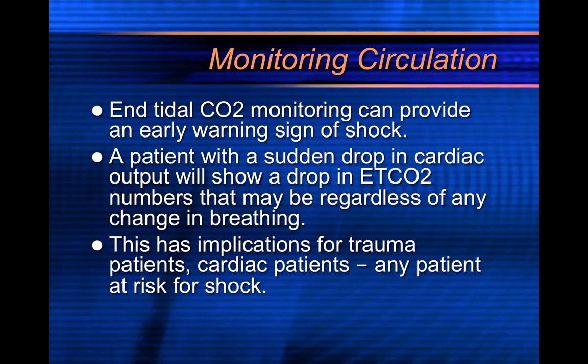Let's say you run on these patients and they've got a known infection and they've got really low end-tidal CO2 values. That patient has an actual low indication of survivability. They might die soon after your care, not on you, but in the hospital, because that low value is an indication of septic shock in those patients. So just use end-tidal CO2 to monitor circulation as well as ventilation, because it can indicate that these patients are going into shock or cardiac arrest.